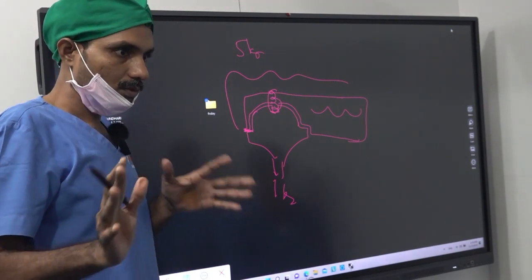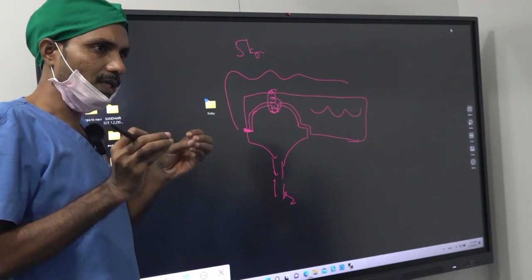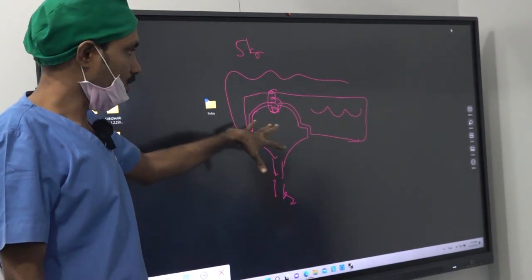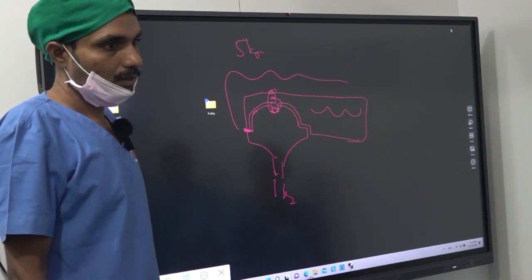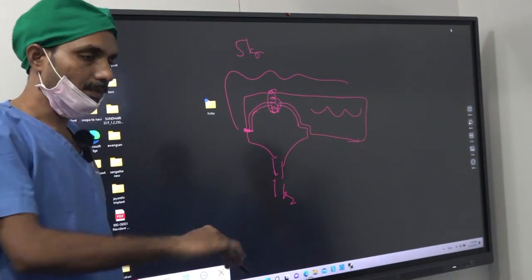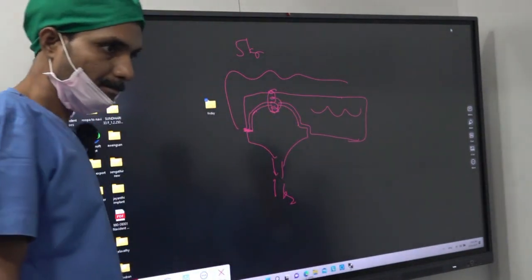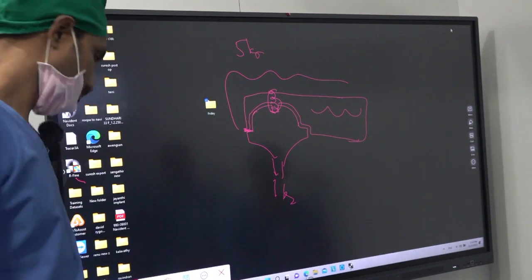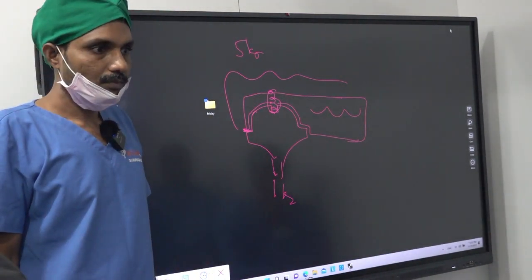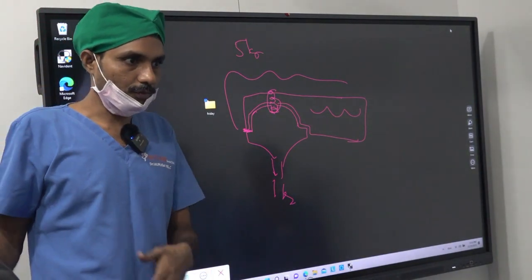So in difficult cases, challenging cases, where inter-implant distance is more or there is very little bone, we use this multi-unit. In conventional also, this multi-unit is used. We are using that single piece multi-unit. Single piece multi-unit, and they construct the titanium bar. Yes, they will do that. Also show the acrylic metallic bar. The prosthetic segment will come after that.